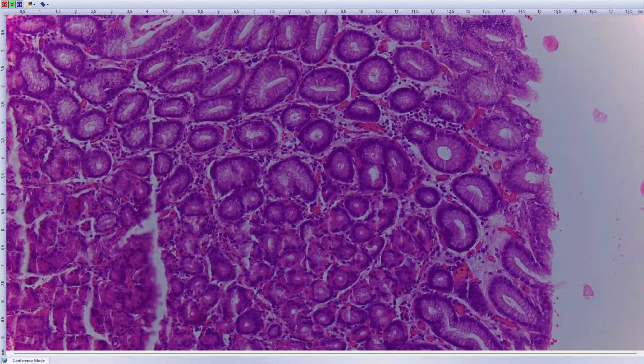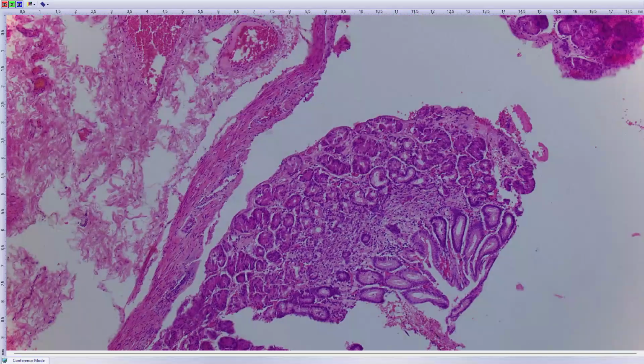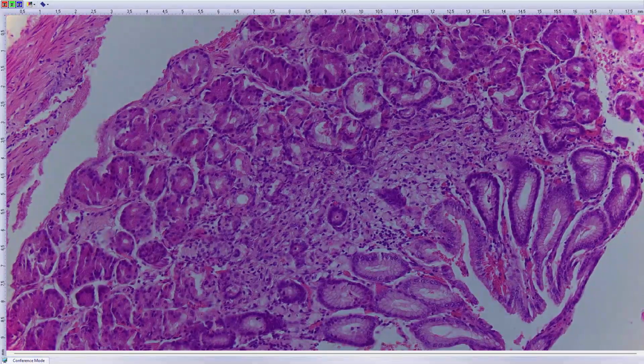So she underwent prophylactic gastrectomy, and I submitted the whole stomach into blocks, and I sat down for several hours to look at all the slides. Macroscopically there was nothing, but already here microscopically you can see very early diffuse signet ring carcinoma, or according to the WHO classification, poorly cohesive carcinoma. I had more than 120 slides. I found the gastric cancer in eight slides, eight blocks, and there were 10 separate foci of very early carcinoma.